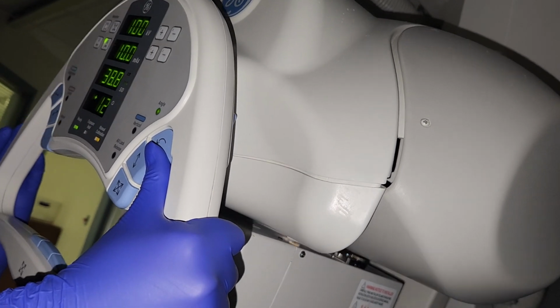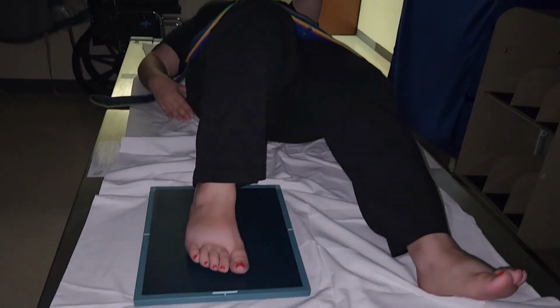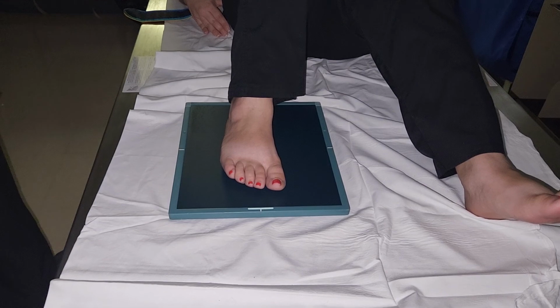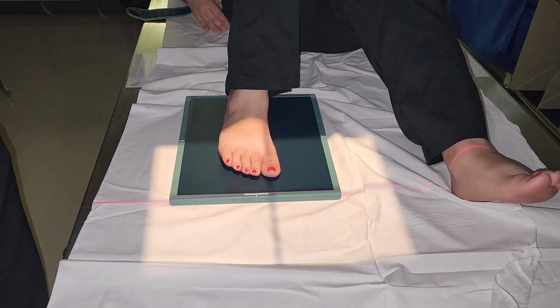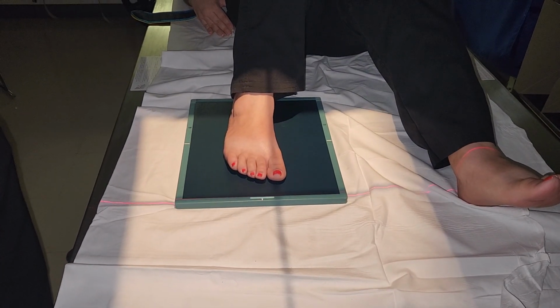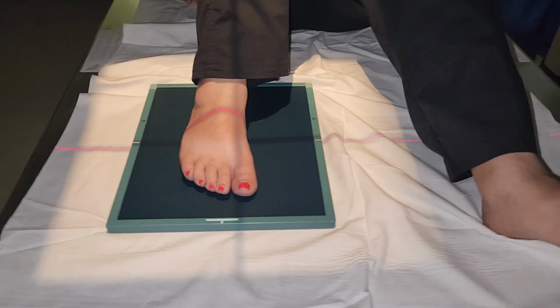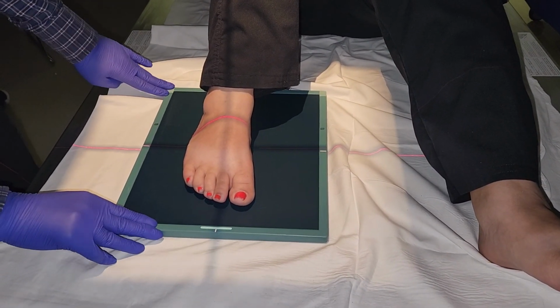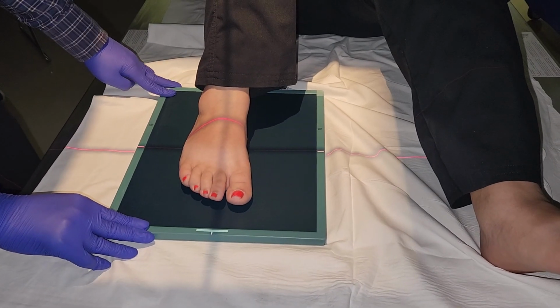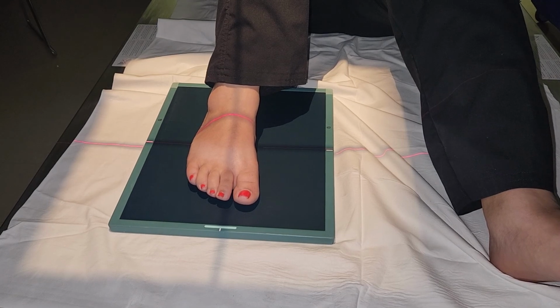So AP foot is 10 degrees. Toes are 15, feet are 10. Let's slide this over. Make sure we center to the IR. Alright, and now we need to figure out the centering for the foot.